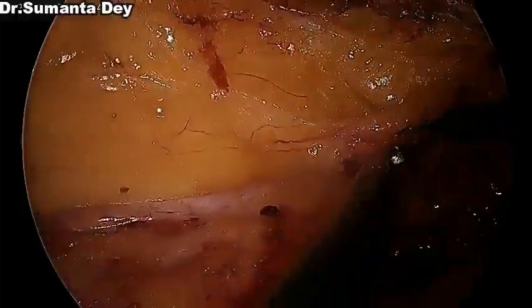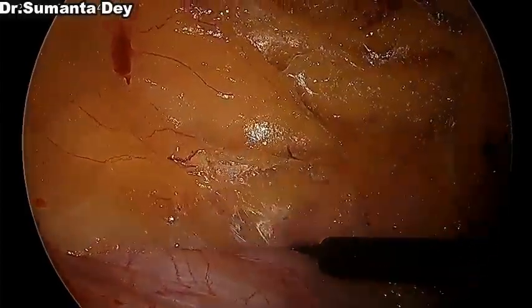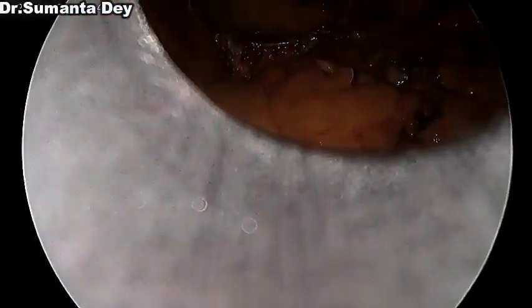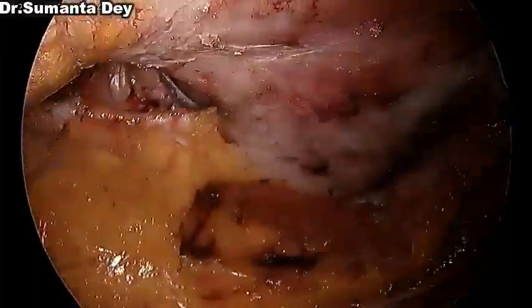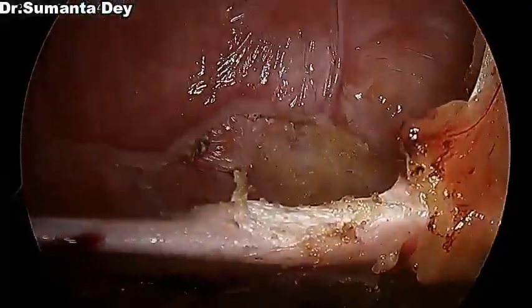You can see the lateral abdominal wall fat, which is lying over the psoas muscle and other lateral abdominal wall muscles, is nicely sitting over that area. That should not be excluded, because behind this fat there are multiple nerves like the ilioinguinal, iliohypogastric, and lateral femoral cutaneous nerves. Those nerves are protected by the fat.